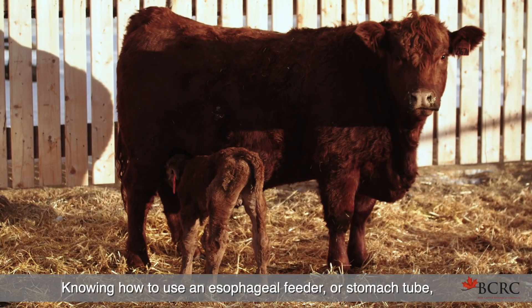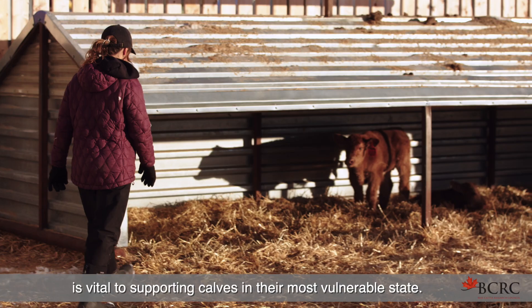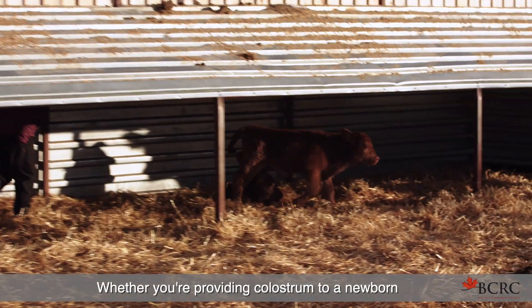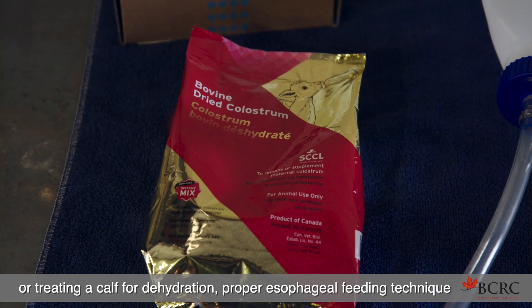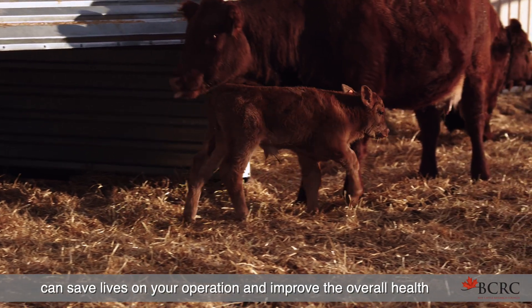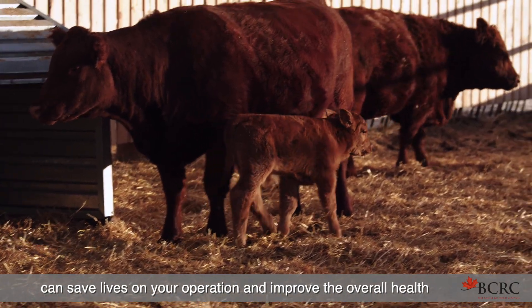Knowing how to use an esophageal feeder or stomach tube is vital to supporting calves in their most vulnerable state. Whether you're providing colostrum to a newborn or treating the calf for dehydration, proper esophageal feeding technique can save lives on your operation and improve the overall health of your herd.